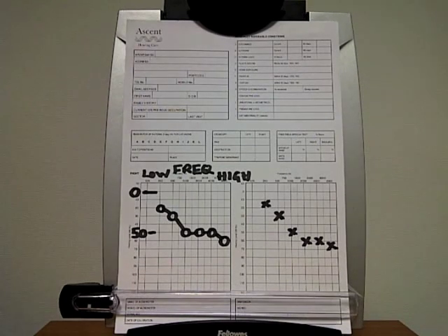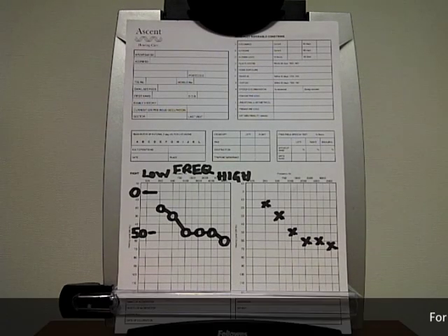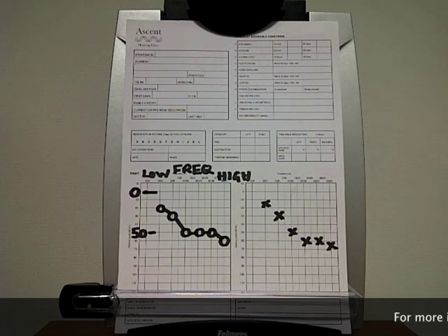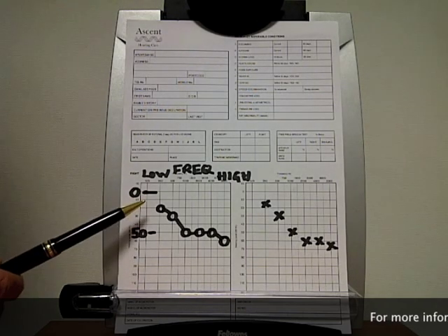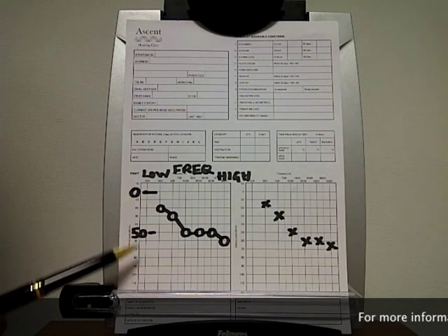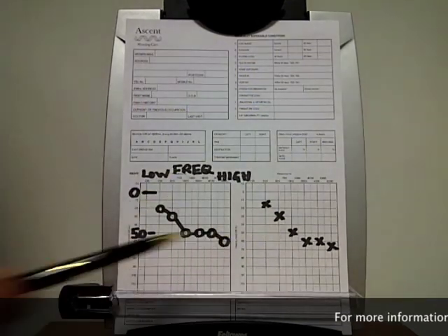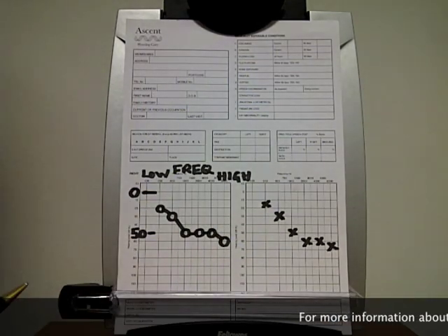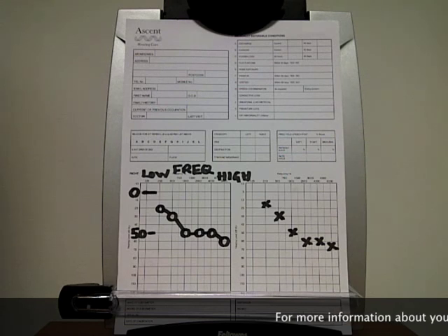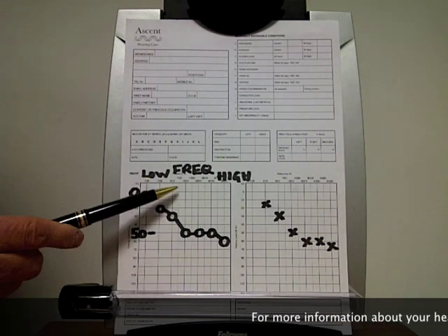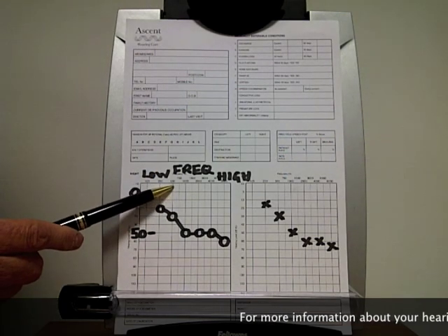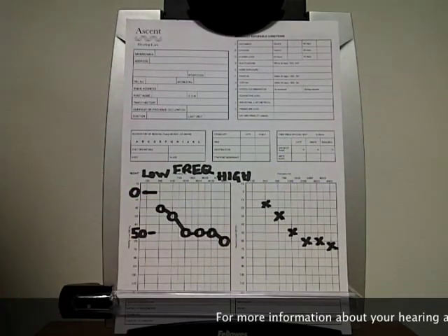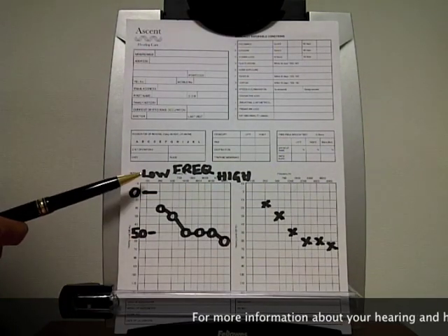I've just completed an audiogram and I thought I'd share with you the results and explain what the actual findings mean. If you look at the picture here, this is what we call an audiogram — it's a record of the hearing loss of the individual. We've got the right ear and the left ear.